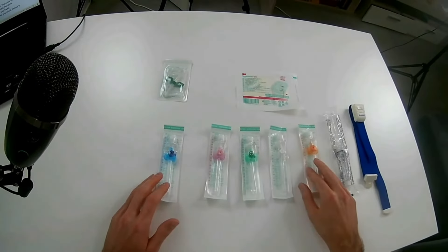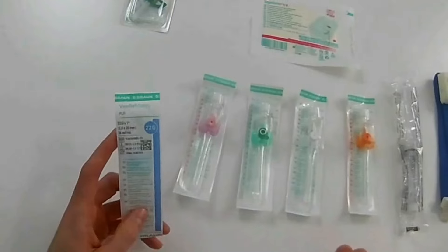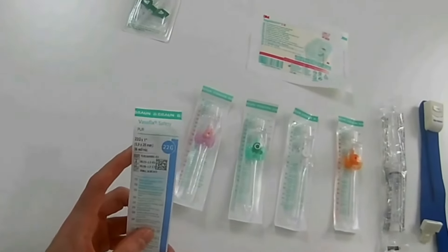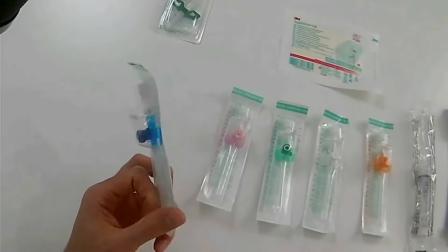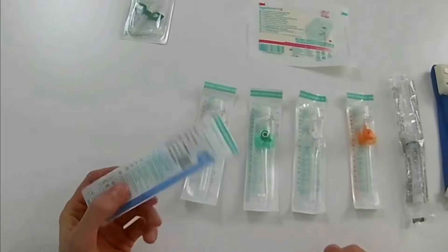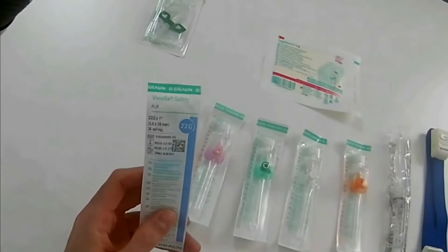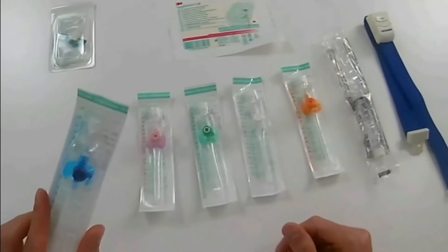They come in different sizes and different colors for different needs that you may have. The smallest one is the blue one, which is the 22G. The bigger the G, the smaller the intravenous catheter. There is a smaller one which is used for babies and very small toddlers, which is yellow color I believe, but I have never seen it or used it.